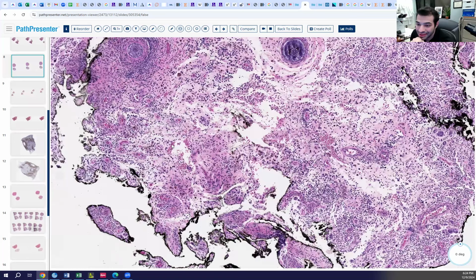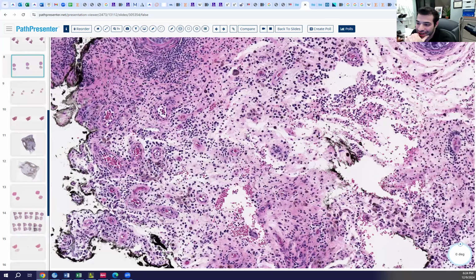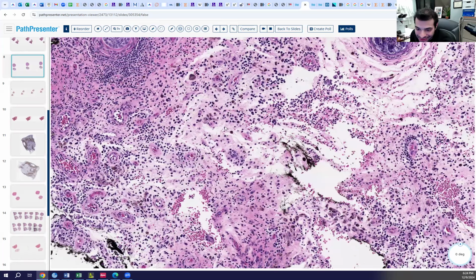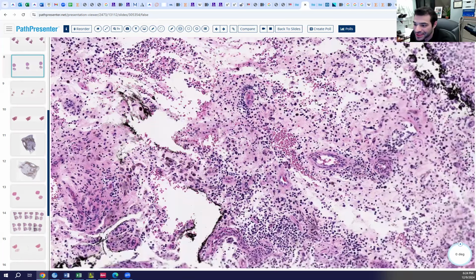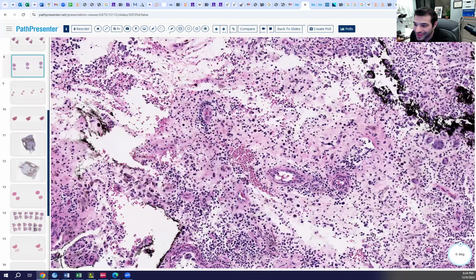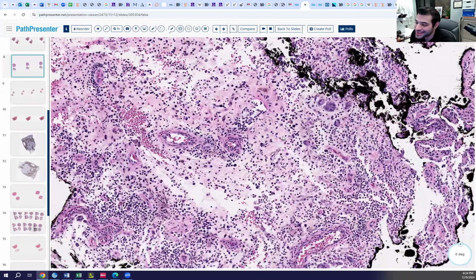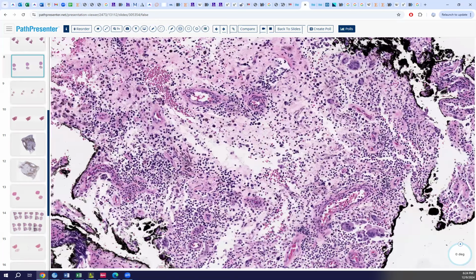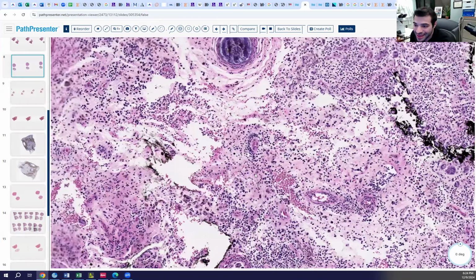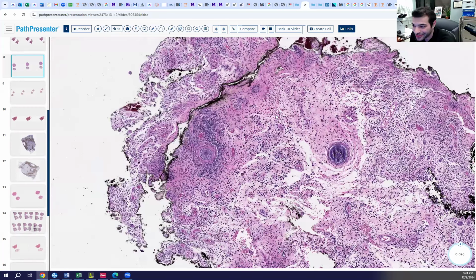It has red blood vessels and some vascular structures, some red blood cells, this loose, edematous stroma, as a wound is healing, as it's granulating. Granulation tissue. Yeah, so at this level the hair is resembling granulation tissue.